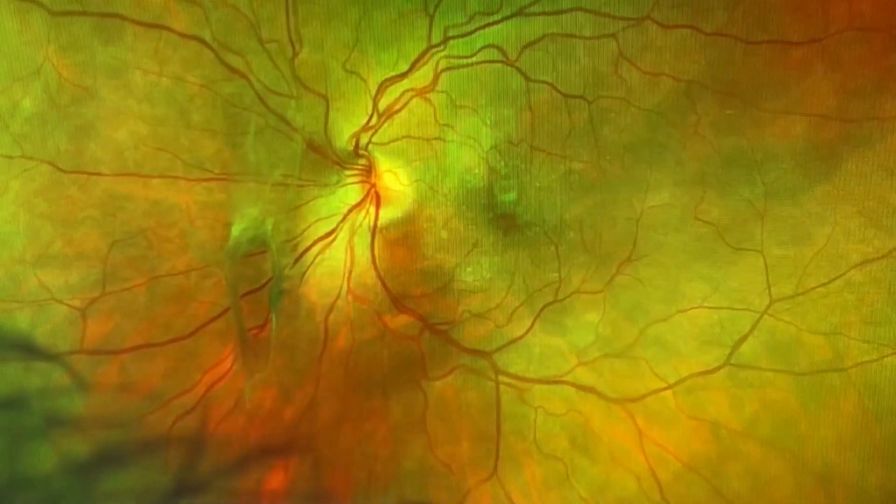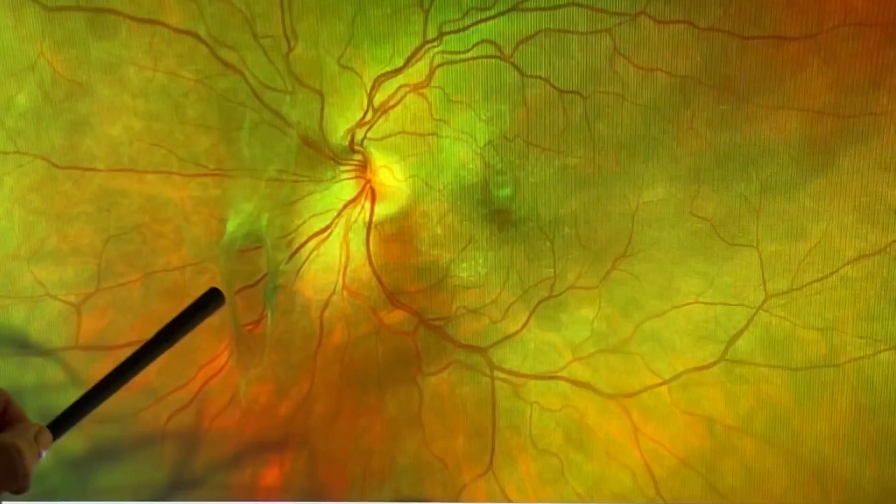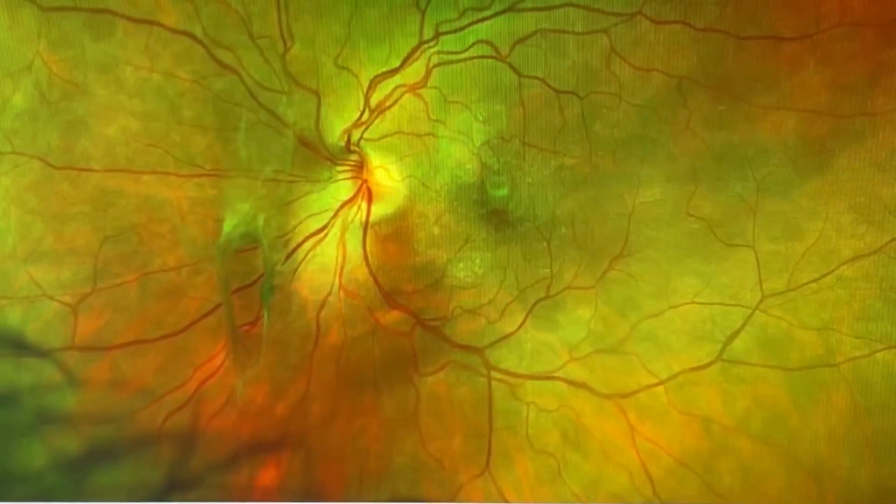This is the optic nerve, the macula, and you can see this very large floater is floating very close to the macula which gives us our very best vision.